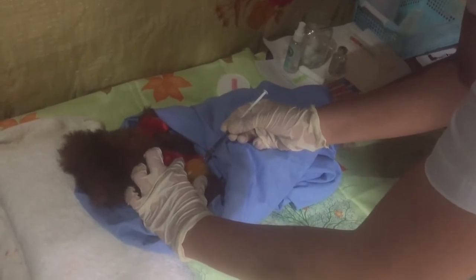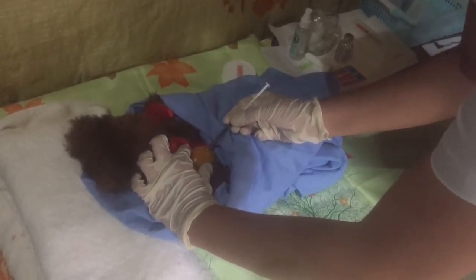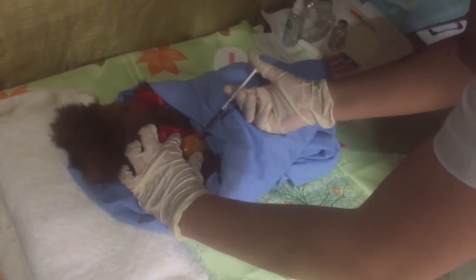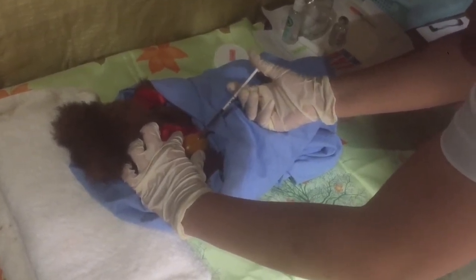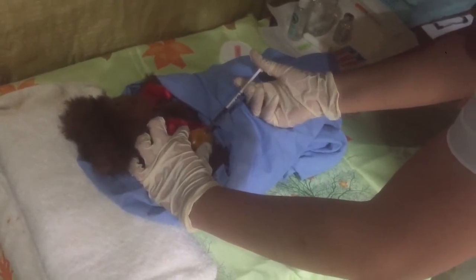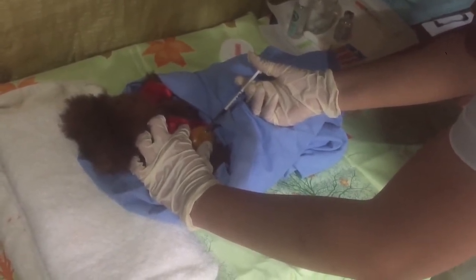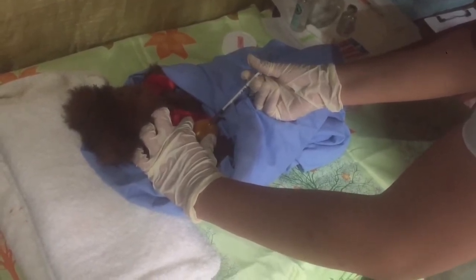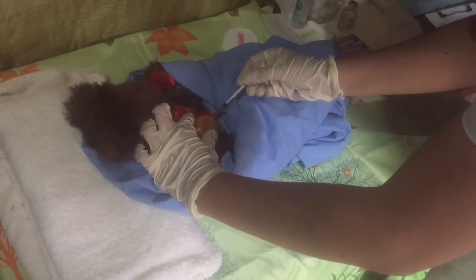Hold the syringe with your thumb and finger. Make sure to lay the needle almost flat along the skin at a 10 to 15 degree angle. Gently insert the needle into the dermis of the skin, and then press the plunger slowly into the dermis with a thumb. Once the needle is in place, slowly inject the solution, watching for a small wheal or bleb to appear. And withdraw the needle at the same angle.